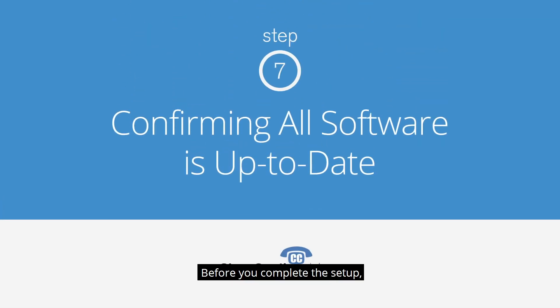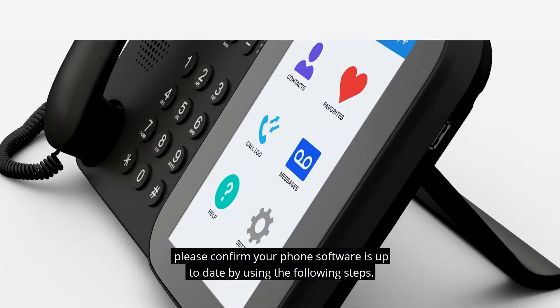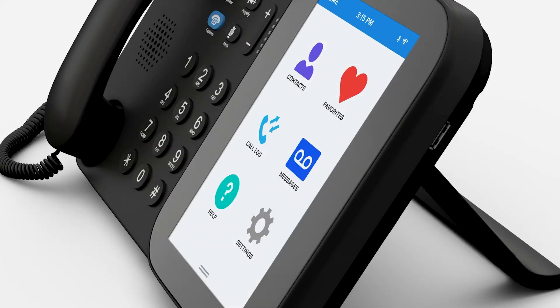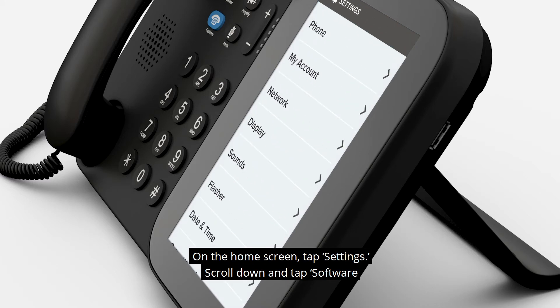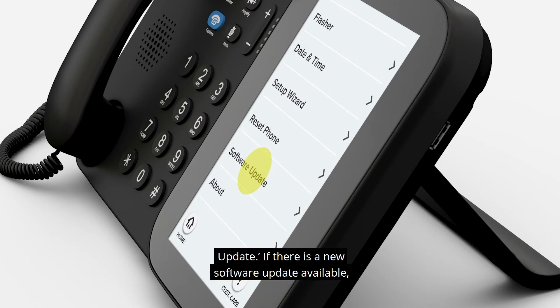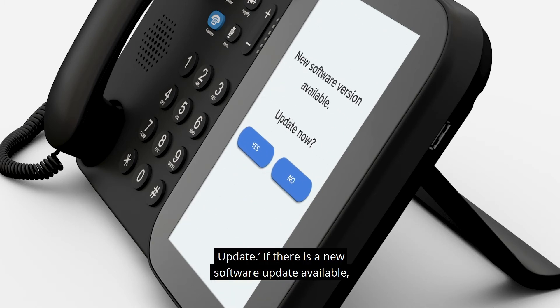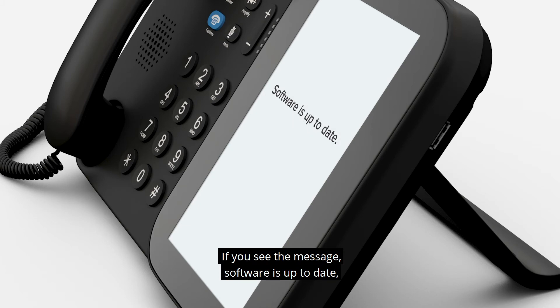Before you complete the setup, please confirm your phone software is up to date by using the following steps. On the home screen, tap Settings, scroll down, and tap Software Update. If there is a new software update available, you will see New Software Version Available — tap Yes to proceed. If you see the message Software is up to date, you are all set and can move on to the next step.